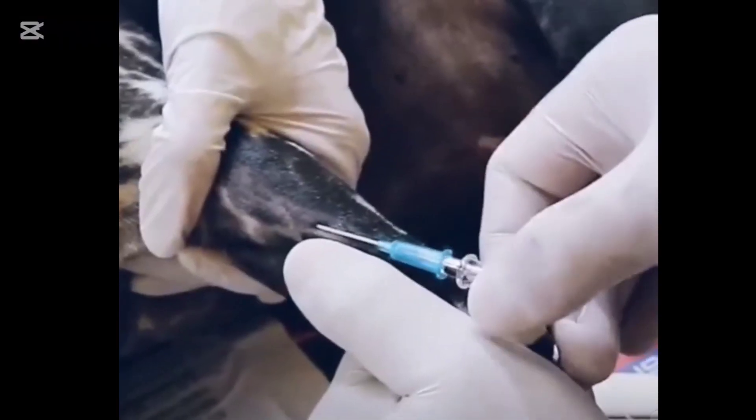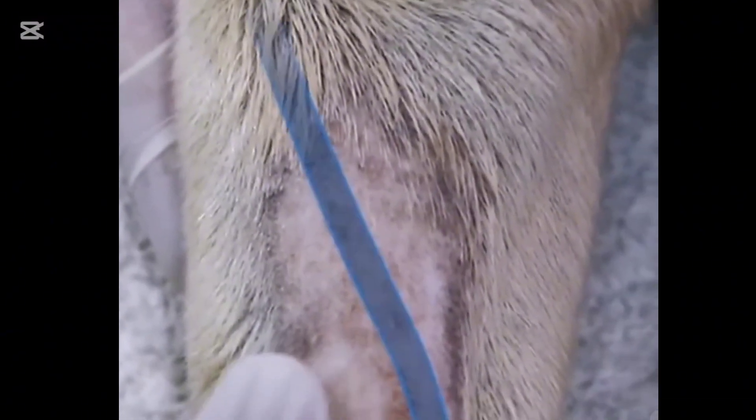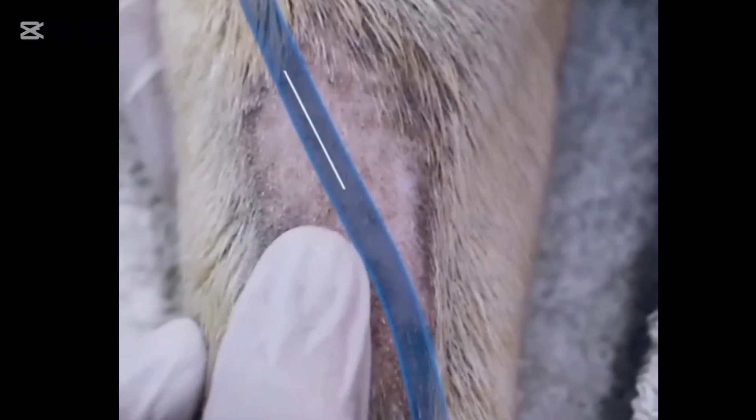In veterinary practice, palpate every vein to develop familiarity and to tell the differences between veins. Visualize the vein's path in your mind's eye following palpation — this will guide you in how to direct the catheter.